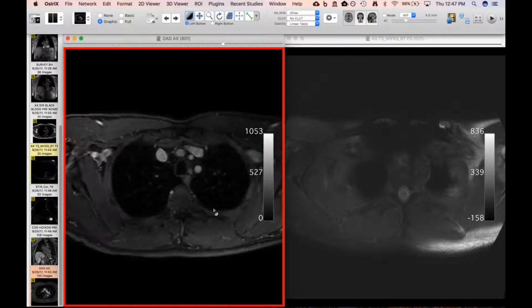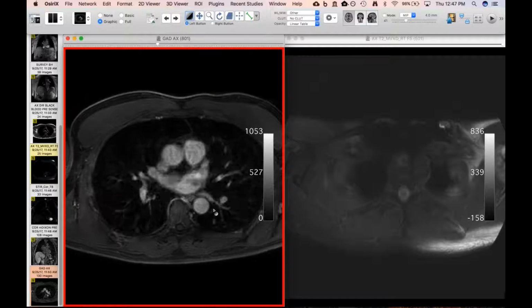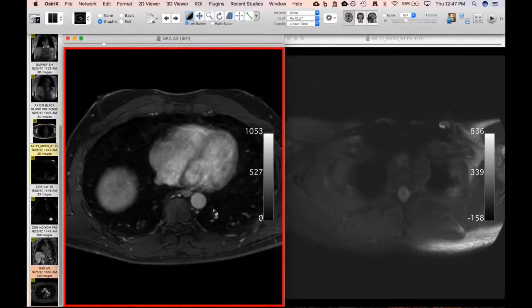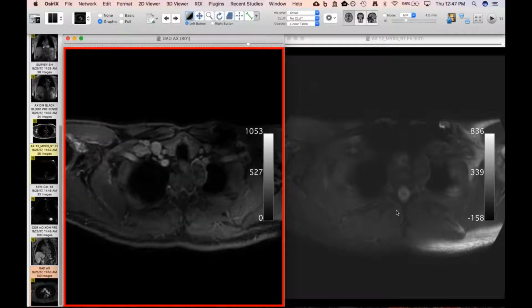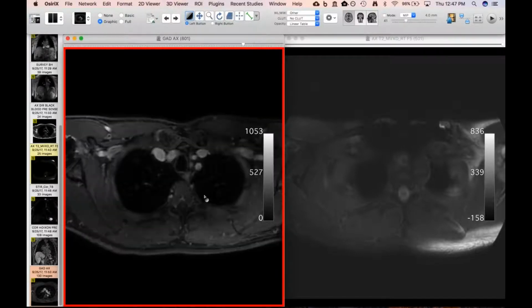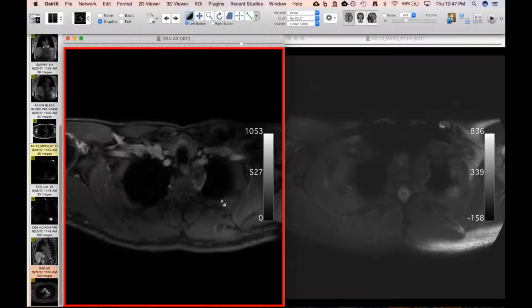So I'd call this loosely posterior mediastinum, but the moral of the story is never bet against cancer, even if it's slow-growing. And just a solitary metastasis, as far as one knows, huh? That's unusual. Yeah, probably through the lymphatics, maybe via the thoracic duct, it ended up here. It's not a Virchow's node, but I'm just trying to think of why it would end up right there. I don't know, that's the best I can come up with.